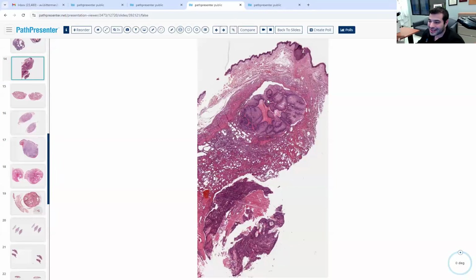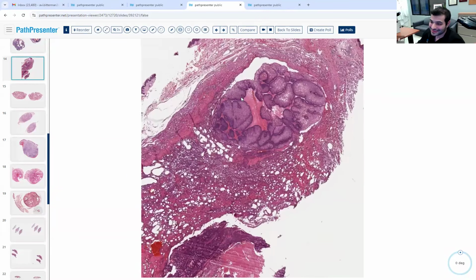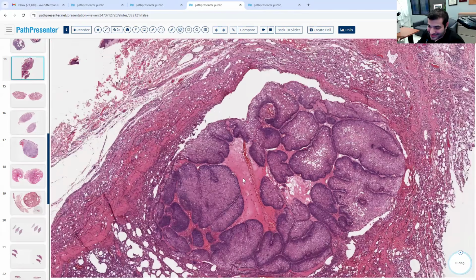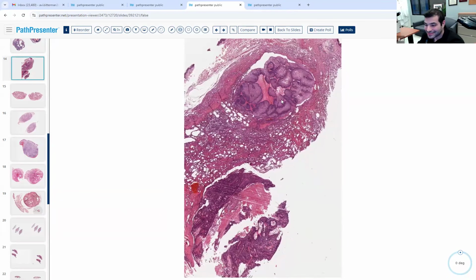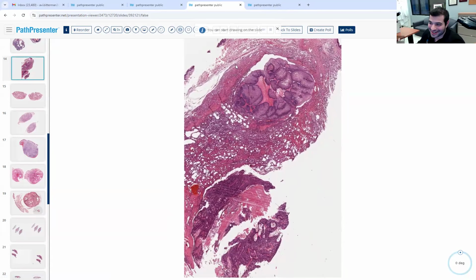Now what's going on here? First off, before we even get to the differentiation, benign or malignant? Malignant. Good. Here's a chunk here. Somehow another chunk got all the way down here.